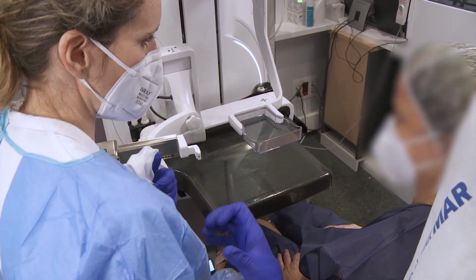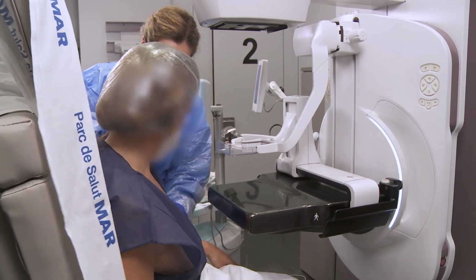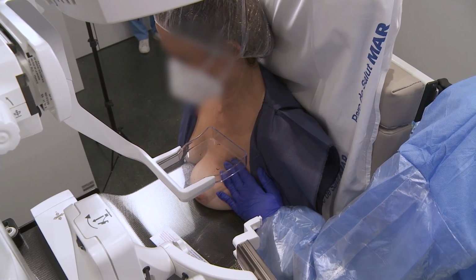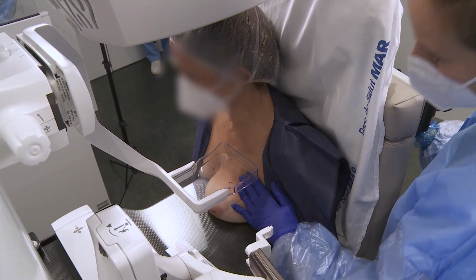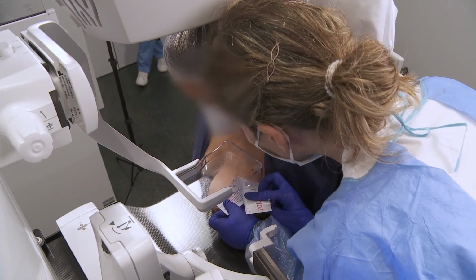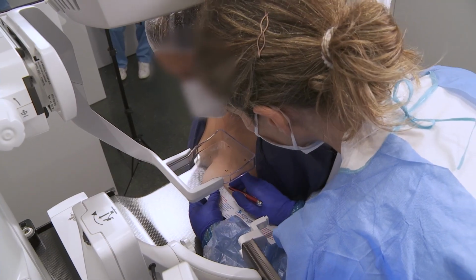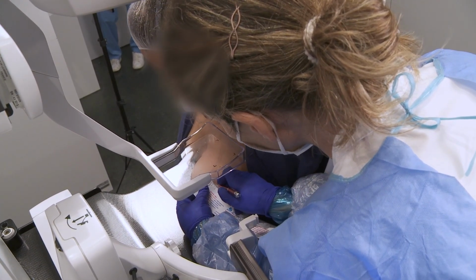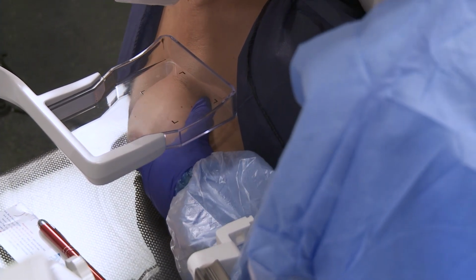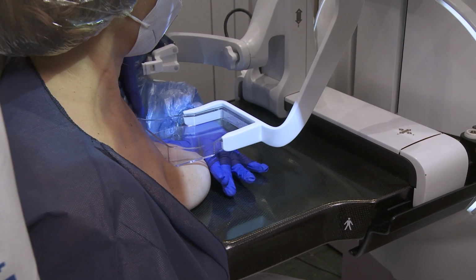When positioning the patient, pay special attention to her comfort. The patient is positioned for a craniocaudal projection, horizontal approach, with external access procedure. The measurements taken previously on the craniocaudal projection image are replicated on the breast to facilitate positioning. Adequate breast compression is applied.